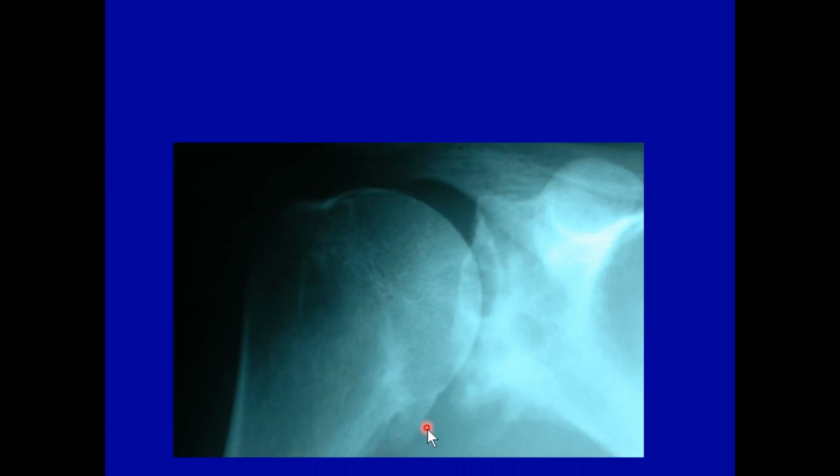There's an osteophyte formation here, but it's this superimposition of the humeral head onto the glenoid labrum that we're trying to avoid if we elevate the non-painful side of the shoulder. And even though you took the x-ray that was underexposed, it's still of use when we're evaluating it, because there's calcium where there shouldn't be calcium in the subdeltoid bursa. We can still make the conclusion, and we can make the recommendation to the referring doctor, this patient needs an orthopedic consult.